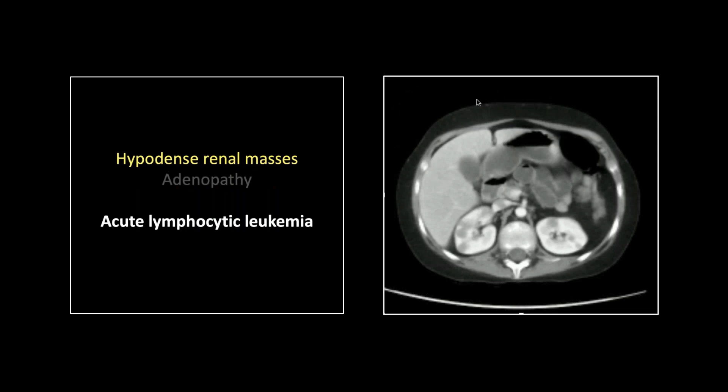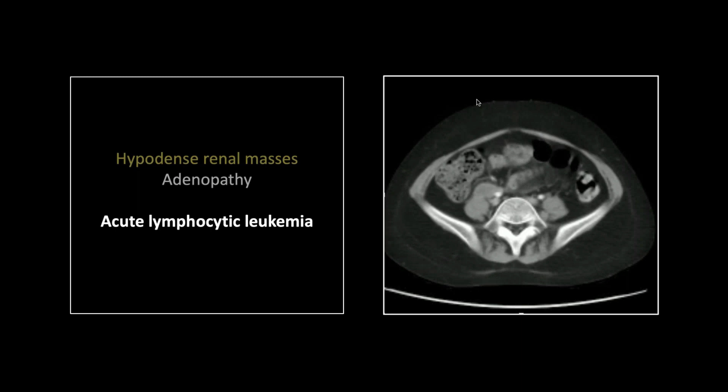Our next one is an ALL — this one in an adult. This really struck me because I always remembered learning this when studying for boards: these are hypodense renal masses. Whenever I picture lymphoma involving an organ I think of it as infiltrative, but it doesn't have to be. In fact, the most common manifestation of lymphoma involvement of the kidneys is hypodense rounded masses. This is lymphoma involving the kidneys — pretty typical.